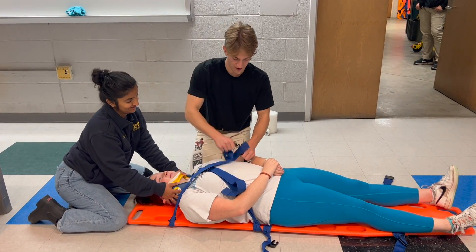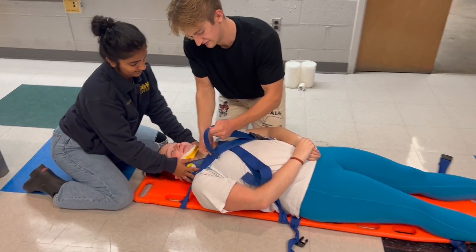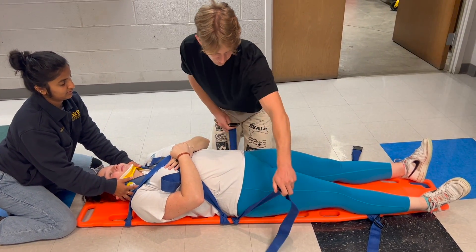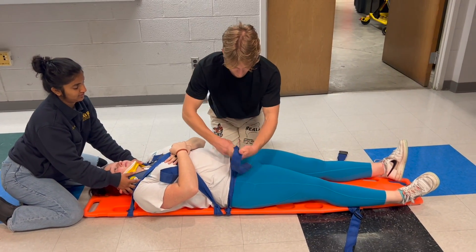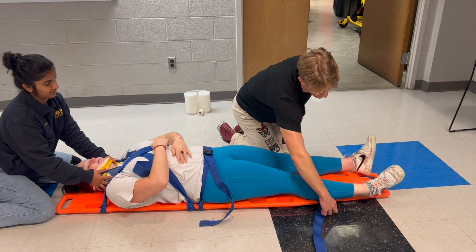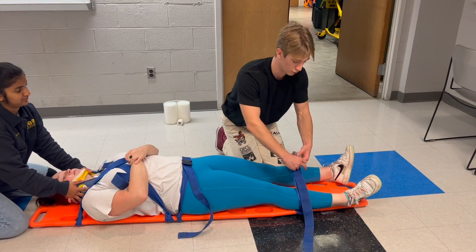These straps go right over the patient's shoulders — again feeding and tucking. The next straps go over the patient's hips, not the stomach, because that is a more secure fit. We use the same tightening technique, and note that we are strapping from the top of the body down toward the feet.